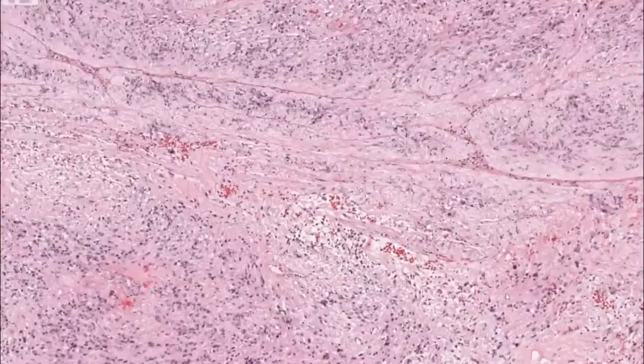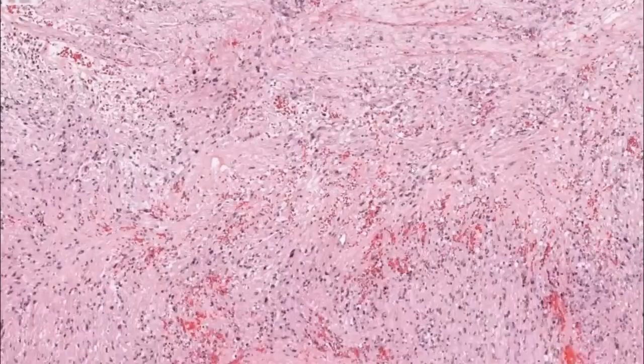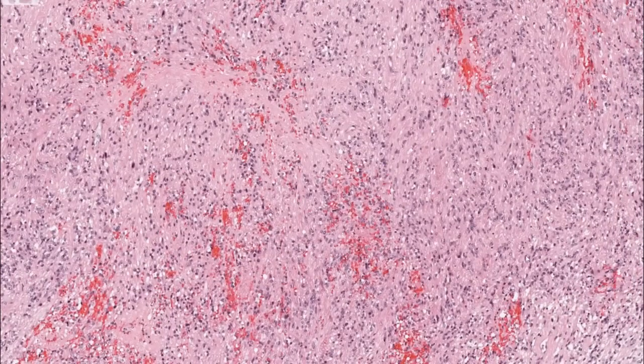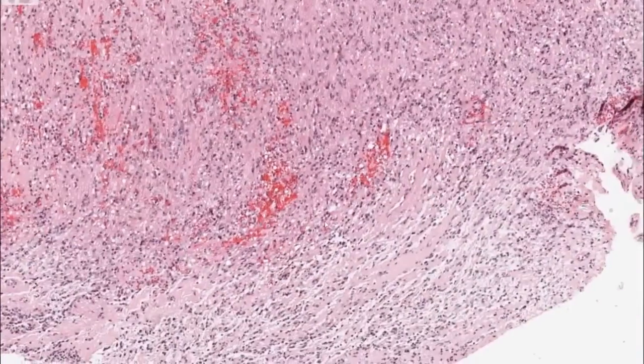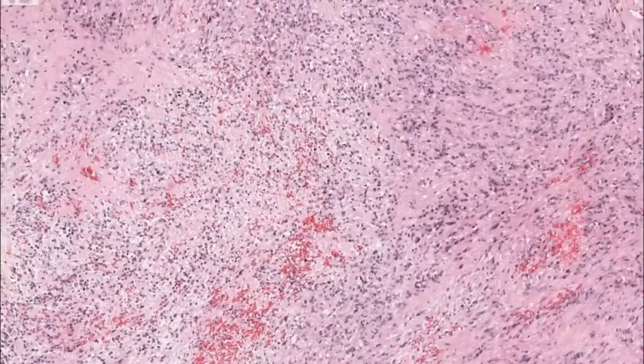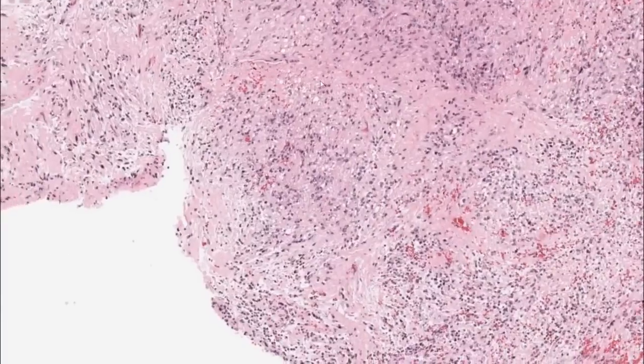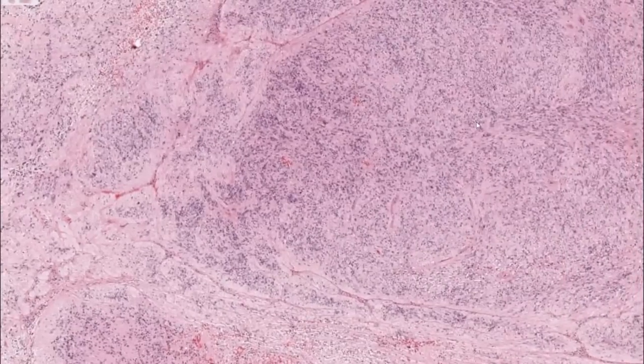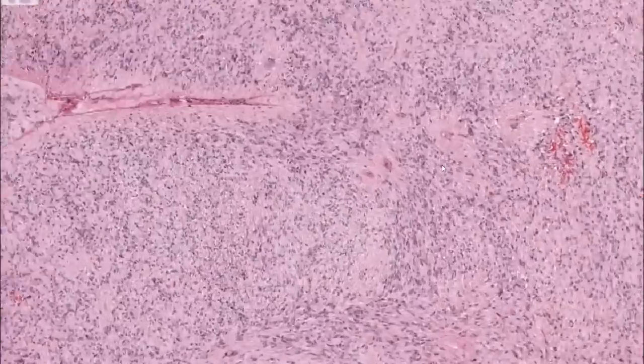Again, you continue moving around and see a lot of the glial background. And you see in areas, the cellular rosettes are not always in all areas. So it's something to have in mind that you have to really look around in these tumors. And you will find areas that are more convincingly ependymoma. But circumscription, nodularity, pseudorosettes, these are some good ones.